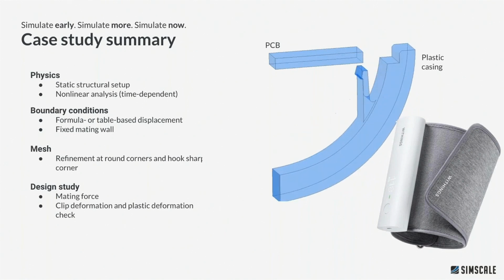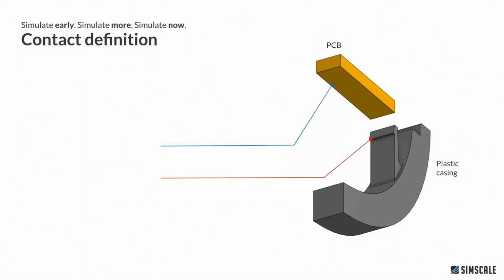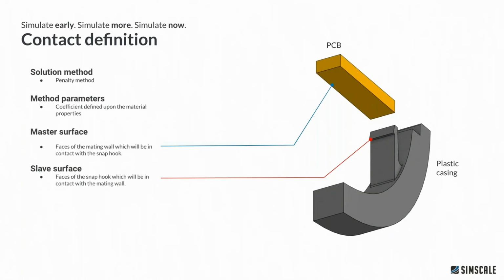Then we move on to the contacts. And we need to define a physical contact to avoid the overlapping of these two parts during their assembly. As the plastic casing is going to move up, we don't need it to overlap the PCB. We need to exceed the PCB and then mate the upper surface of it. So this is required to ensure the mathematical calculations behind the simulation succeed and to obtain realistic results without any overlapping. For this case, we chose the penalty coefficient method and set its parameters according to the material properties involved. So the coefficient is a mathematical approximation, and we can find many ways to define it.